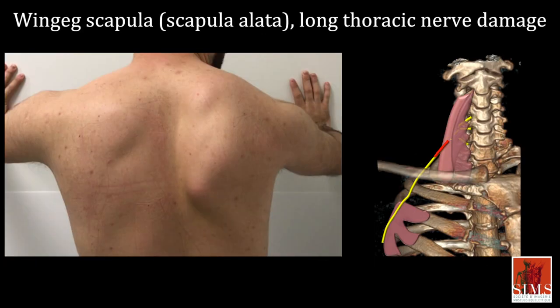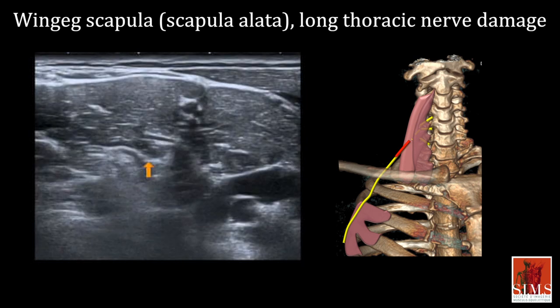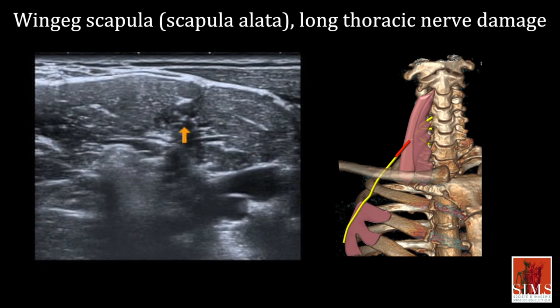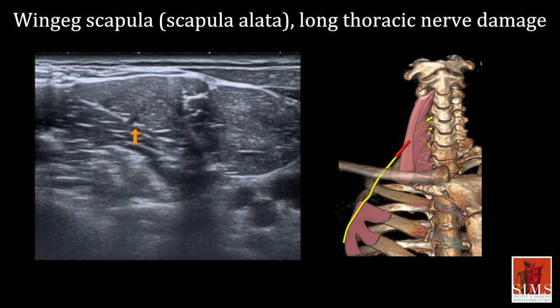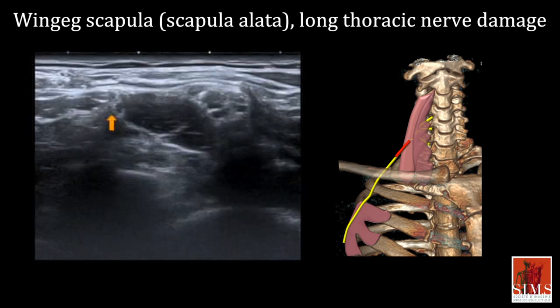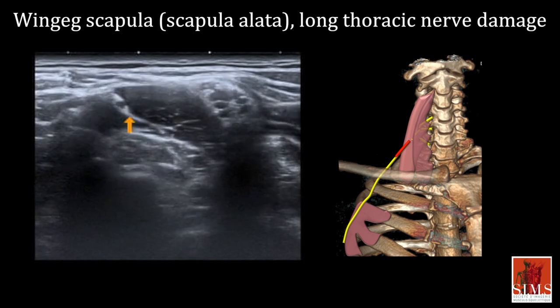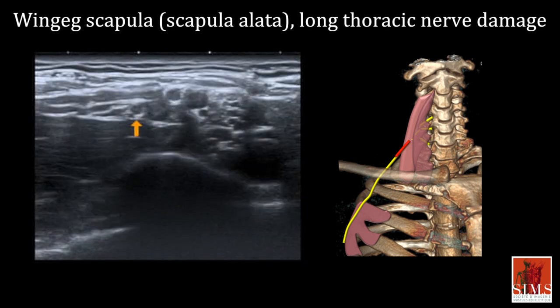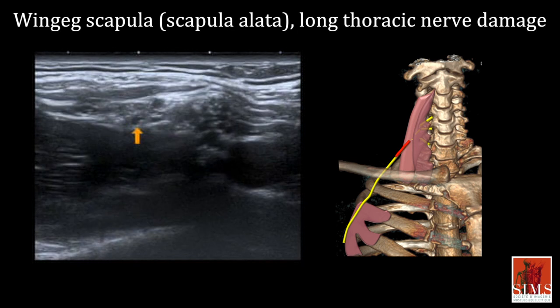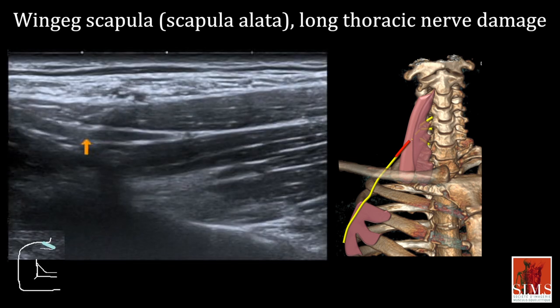Here is an example of long thoracic nerve damage in a patient around 20 years of age who has winged scapula (scapula alata), with gradual onset secondary to his arms stretching when he tried to rein in a horse. Here we are in the interscalene space. In the middle of this space, a small nerve penetrates the middle scalene. This small nerve corresponds to the long thoracic nerve where it emerges from the middle scalene. It is clearly thickened on both the axial and sagittal views.